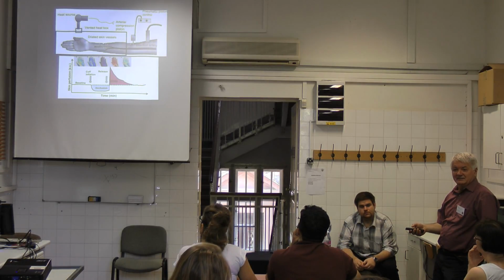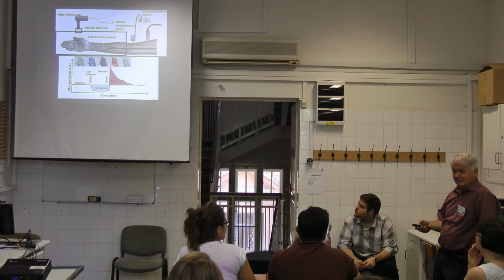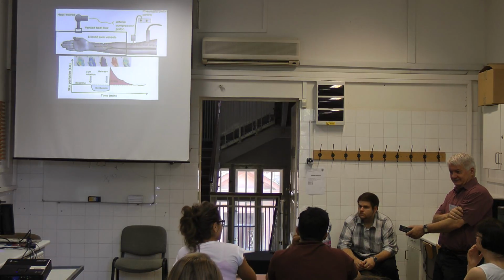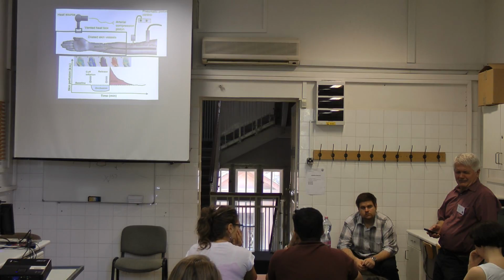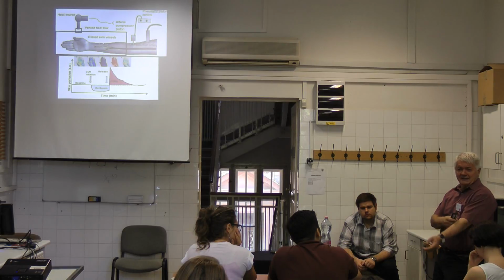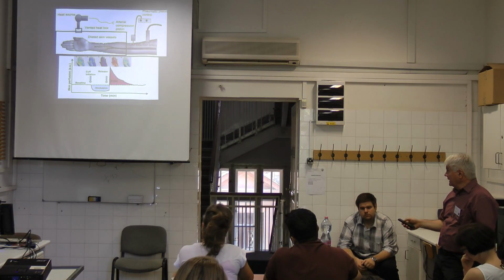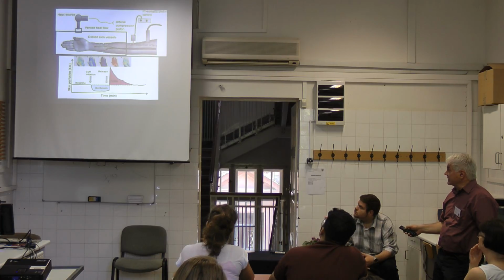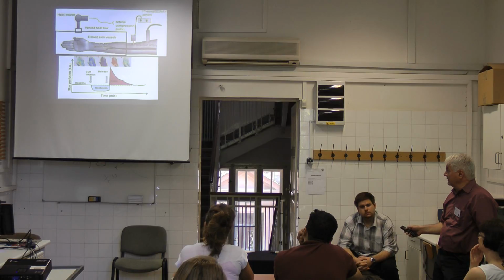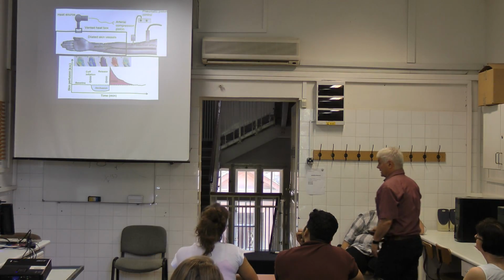After a while, what do we feel? Pain. Why do we feel pain? Because the volume and velocity of the blood coming back into our vessel and forcing new microcapillaries to appear, maybe? No, it's just because the waste material accumulated, because there is no transport, is stimulating the sensory nerves. And of course after it there is a reactive hyperemia, which disappears and it comes back to the normal stage. So these dynamics can be studied very well with the Doppler method, and as I mentioned, the dynamics can be analyzed.